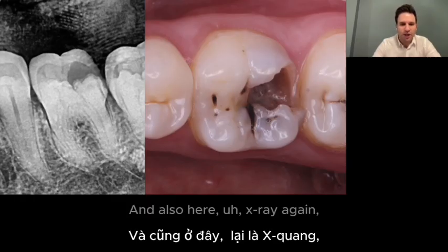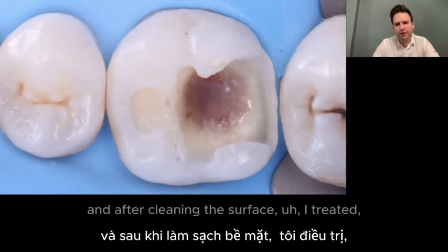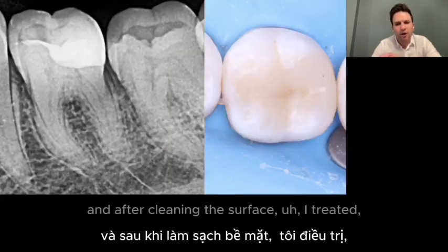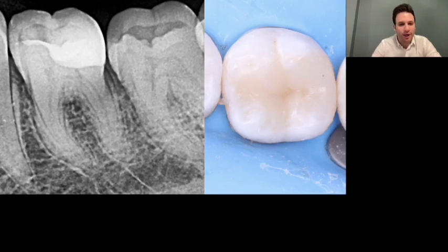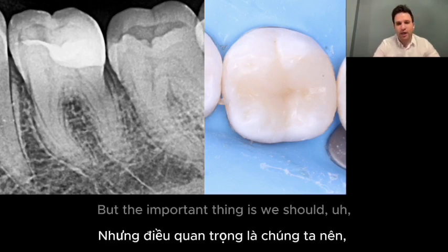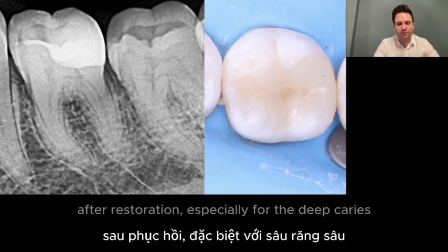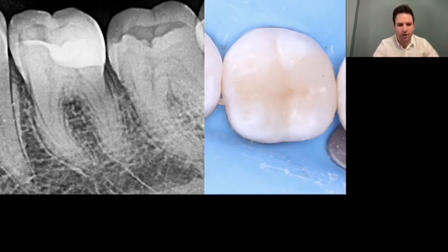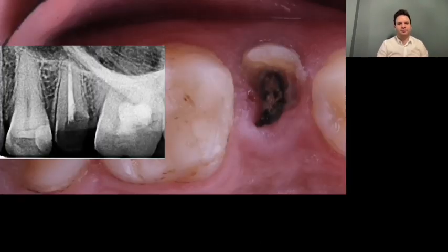And also here, X-ray again, and after cleaning the surface, I filled the tooth. But the important thing is we should take the X-ray after restoration, especially for deep caries or indirect restoration cementation. So it's better to check the X-ray of the restorations after treatment.